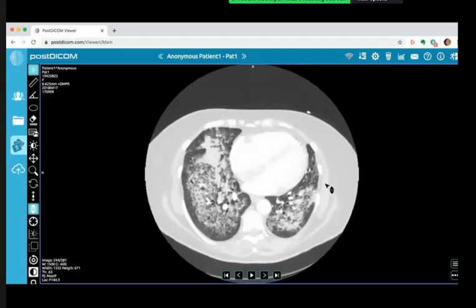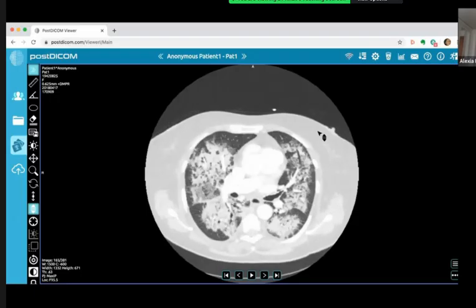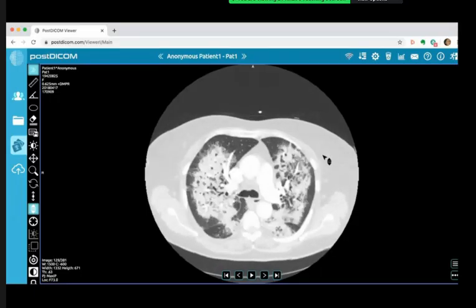Yes. This was pulmonary hemorrhage. Okay. Yes, she presented with hemoptysis. So, is the underlying cause vascular? Not that we know of, but that's a very good point because we need to rule out any underlying vasculitic processes. I will revert back to the presentation.